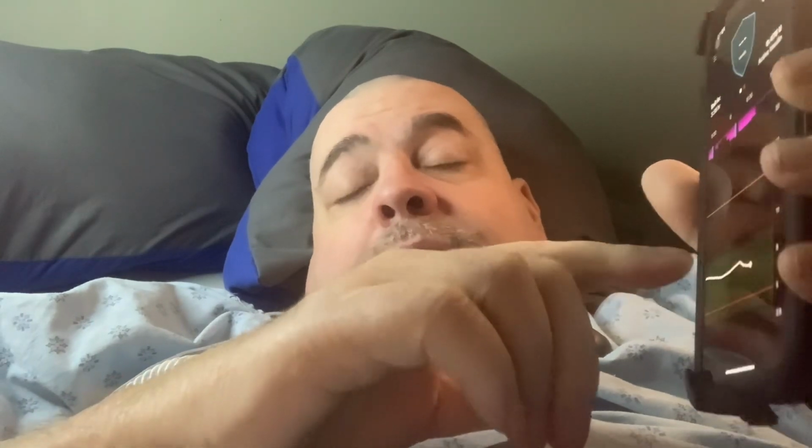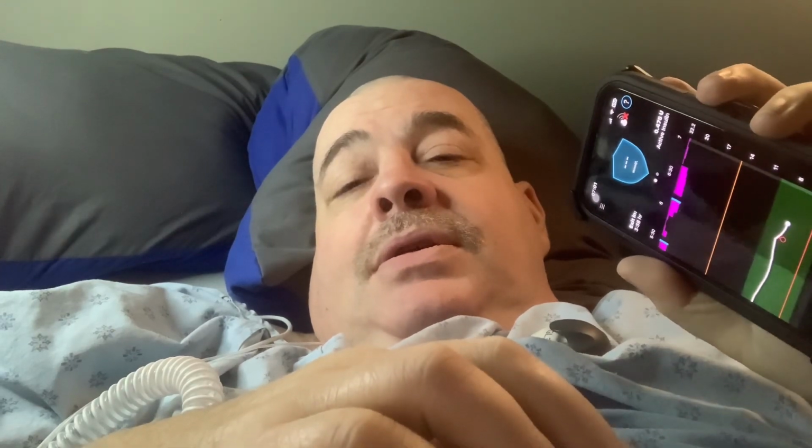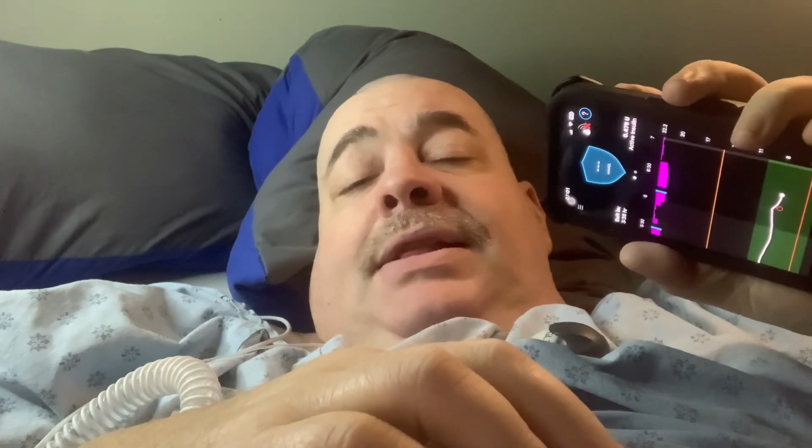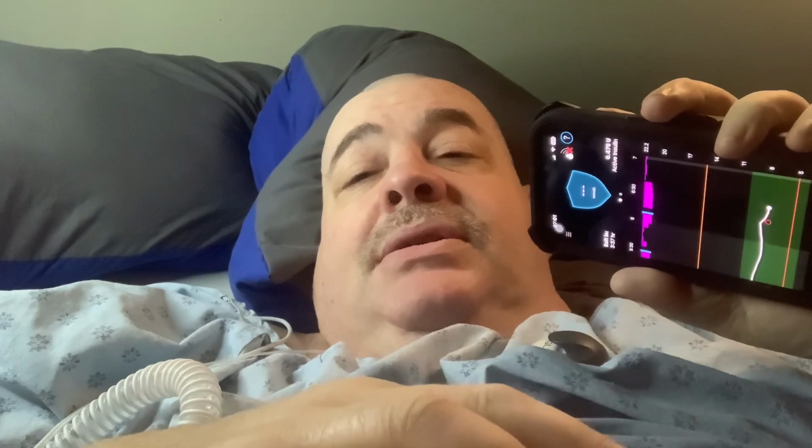You're starting to feel low. Well, you can sort of see, am I tracking low? Am I going high? It's so much. But don't overanalyze. It's important to know where you are. I look at this, I don't know, maybe 8-10 times a day. But it's a quick, okay, that's what I'm doing. And then let's continue on, whether it's doing videos, reading, watching YouTube, whatever.